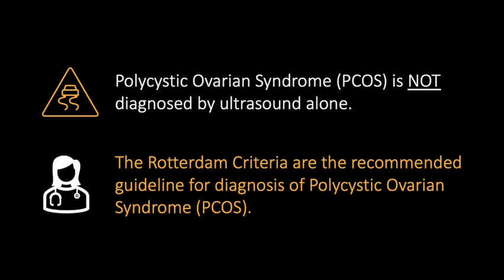In addition to polycystic morphology seen on ultrasound, you also need either clinical or biochemical evidence of hyperandrogenism, so that could be things like hirsutism, elevated testosterone, acanthosis nigricans, and the third criterion is ovulatory dysfunction, specifically oligo- or anovulation. Now you also have to rule out other hypothalamic, pituitary, adrenal, gonadal axis disease to exclude those. But let's get back to the fun stuff and look at these ultrasounds again.